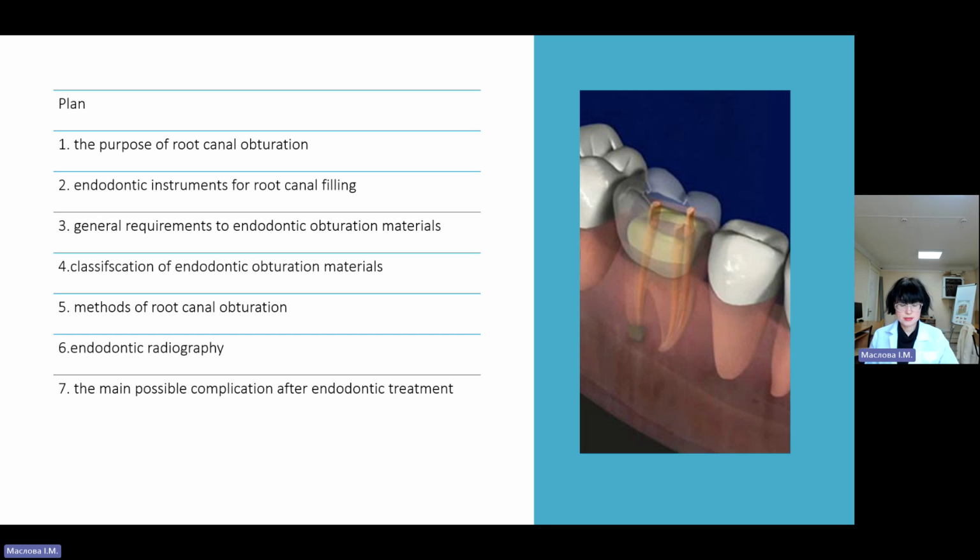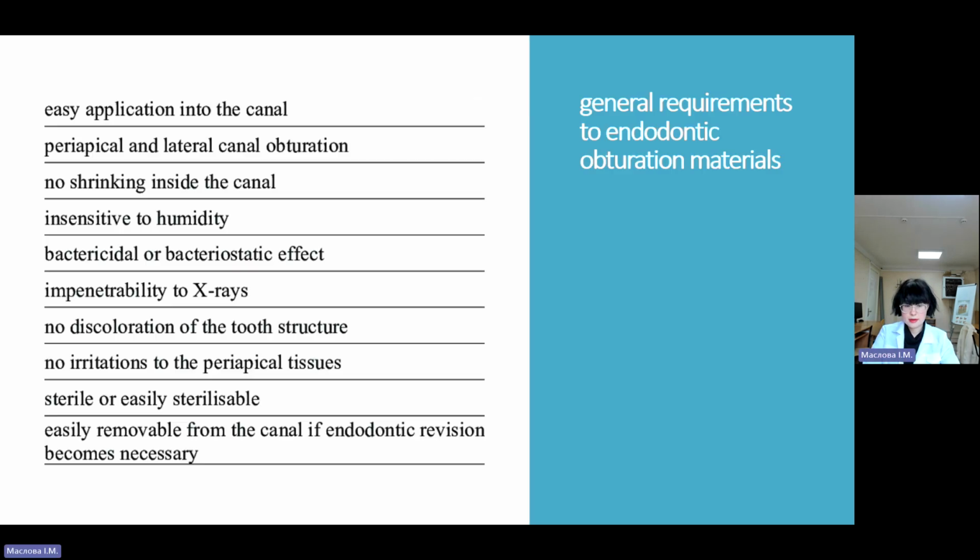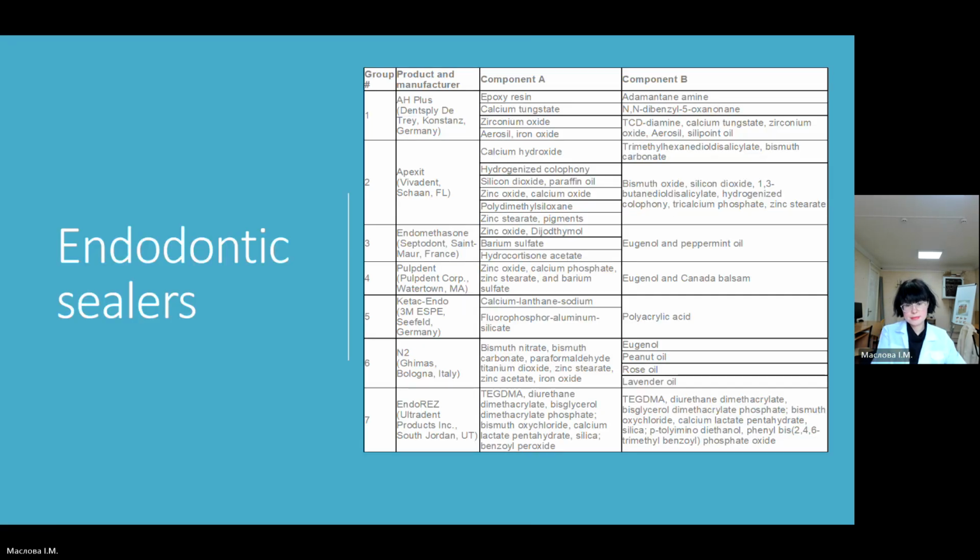However, variations in obturation materials include the sealers. Their classification you can see on your screen. What I have to tell you about the sealers is that there are different types of these materials.